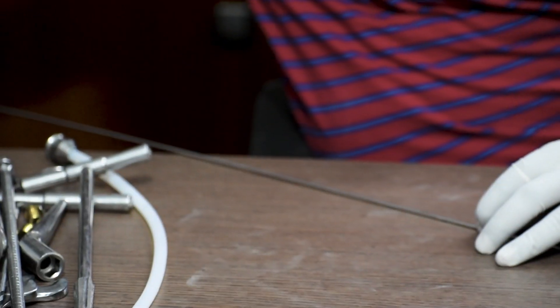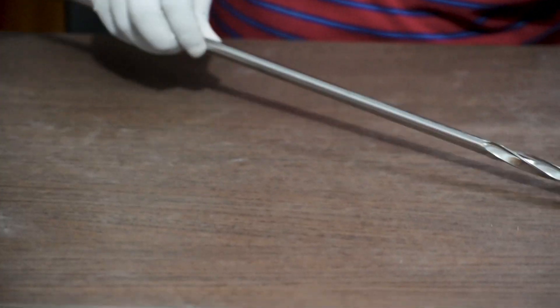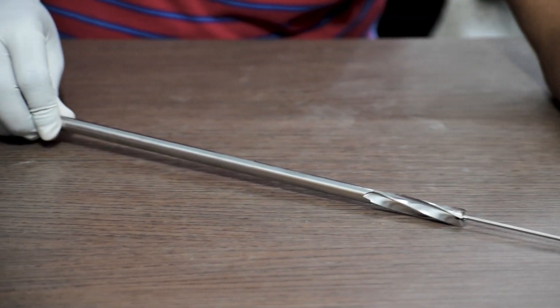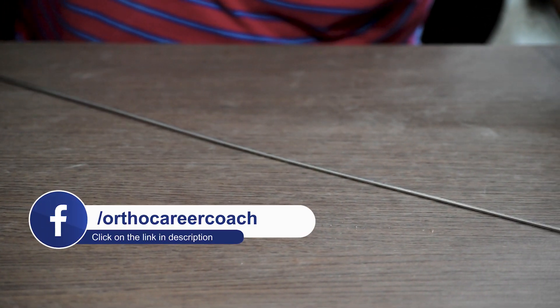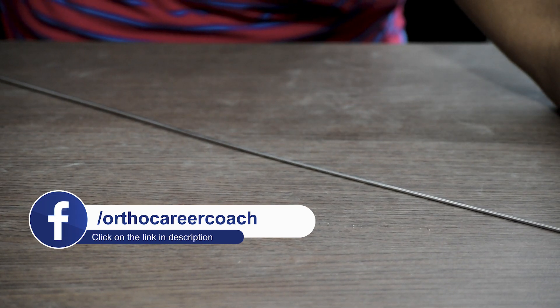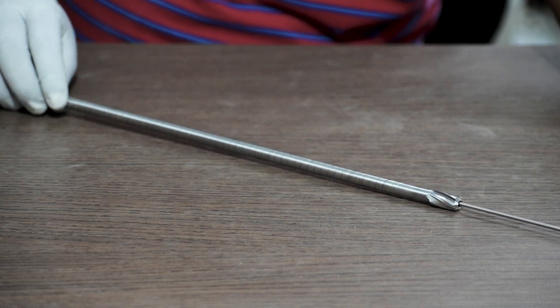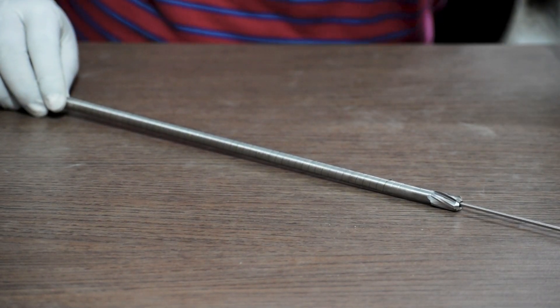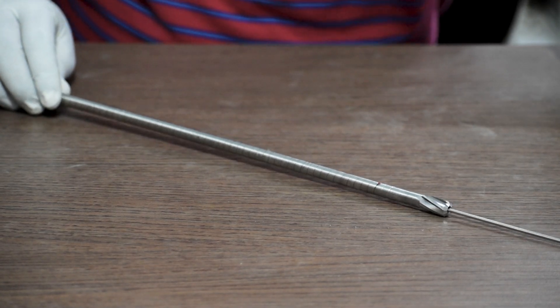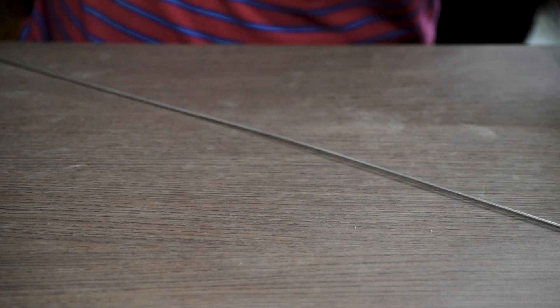Next, we will do the reaming using either the solid hand reamer or the flexible one. Once the reaming is done, we take out the reamer. Here you can see we are demonstrating with the flexible reamer as well. Reaming is done to create a smooth entry for the nail.